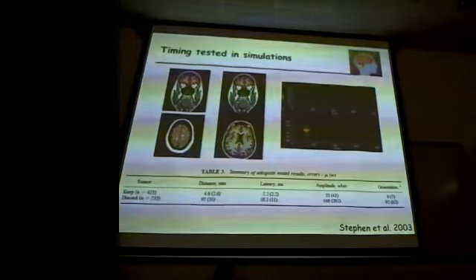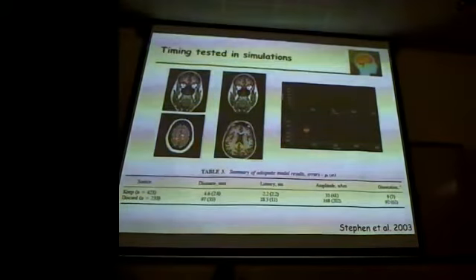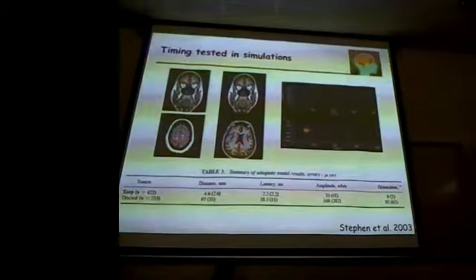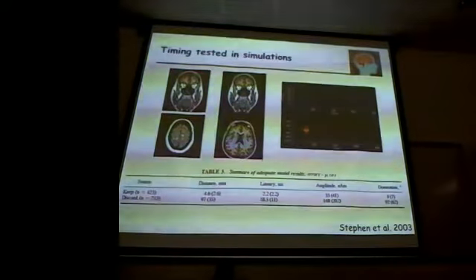And what we were looking at is if you activate sources close by in frontal cortex, because that's where MEG tends to suffer a little bit more in spatial resolution, what is the spatial resolution and what is the temporal resolution that we can capture if we create these simulations and then do our standard source localization.